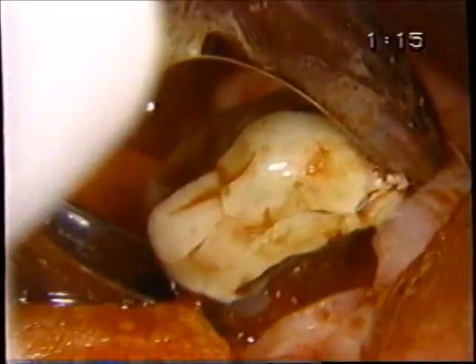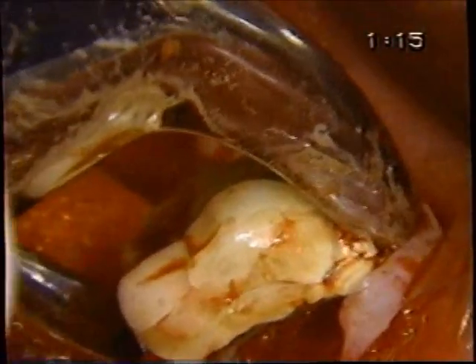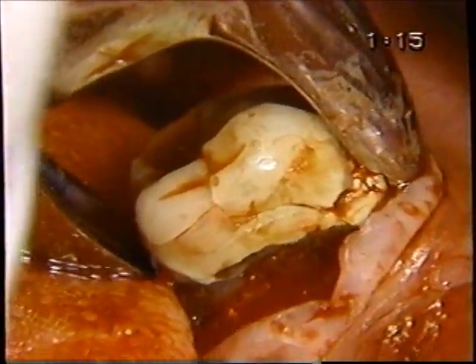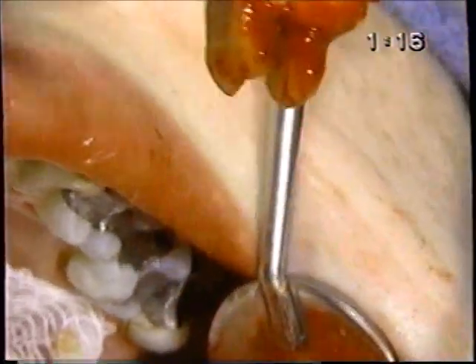We could use the 17 on this molar. We could use the 23. A 17 being like a 151, only with tips that engage into furcations. We could use the 23, which is the cow horn. We're going to use the 151 in this case. Sometimes you engage the forceps for a little more grasping power underneath it, the way I just did. Okay, fairly straight roots.